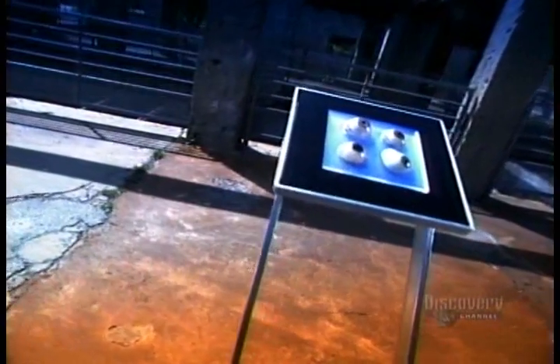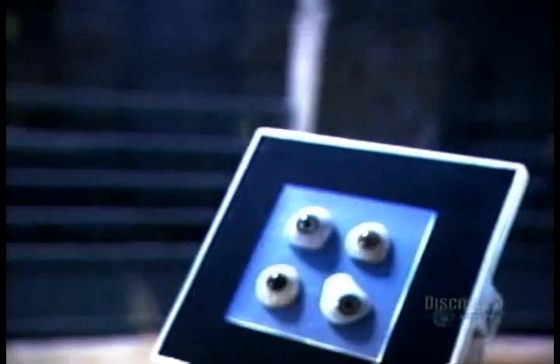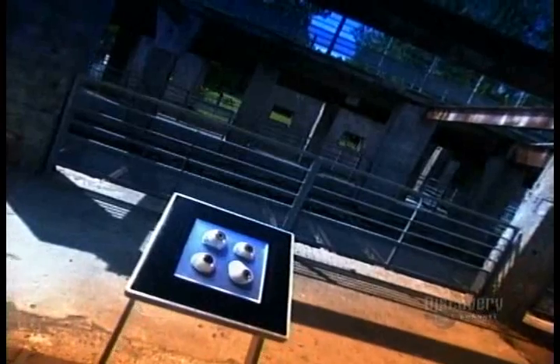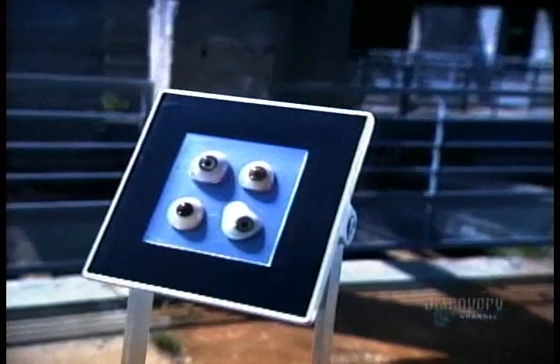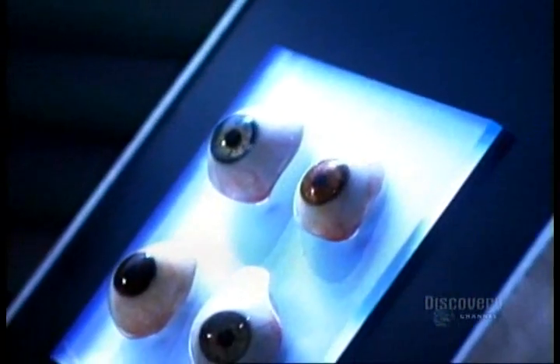The ancient Romans and Egyptians fashioned artificial eyes out of painted clay. By the 1500s, Europeans started making them out of enameled gold and soon out of glass, which remained the norm for hundreds of years. Today, most artificial eyes are made of acrylic.